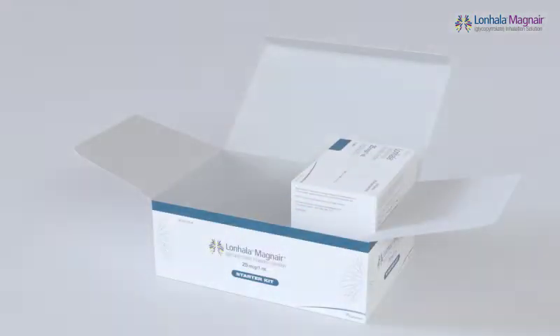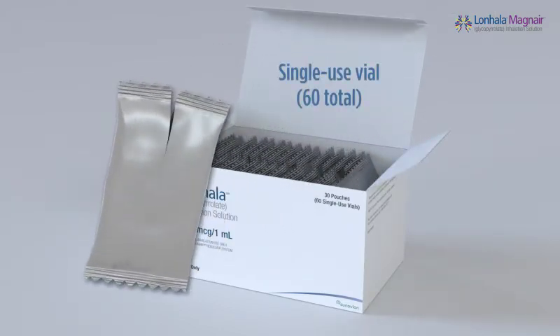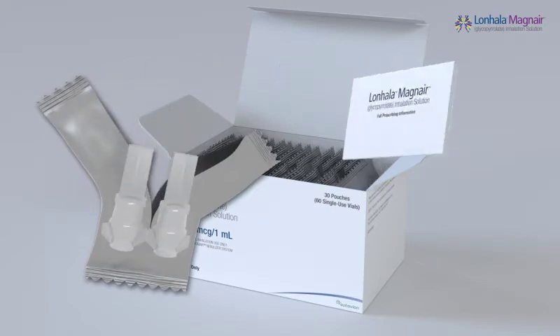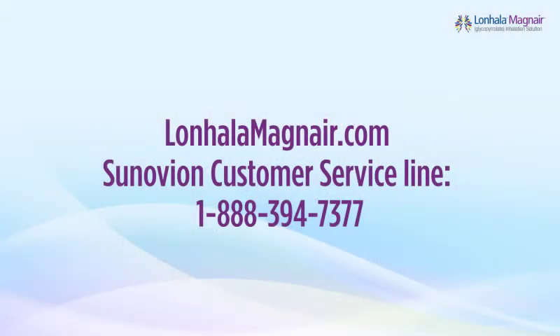The Lanhala supply box contains 30 foil pouches of Lanhala. Each foil pouch contains two single-use vials for a total of 60 Lanhala vials. The Lanhala supply box also contains the Lanhala Magnair prescribing information, including a patient information section. Open the Magnair nebulizer system box and check to make sure you have all the Magnair parts. If any part is missing or you have any questions, call the Synovian customer service line.